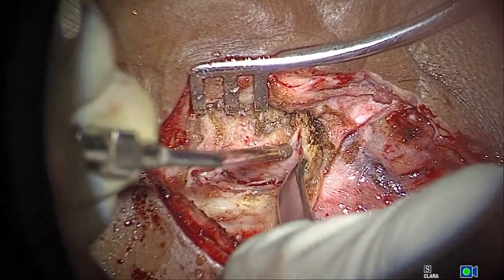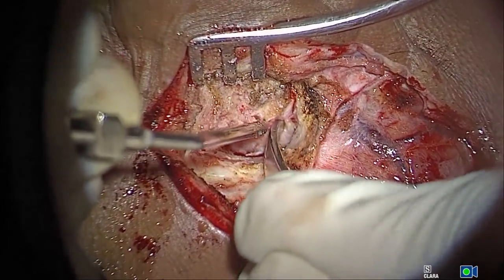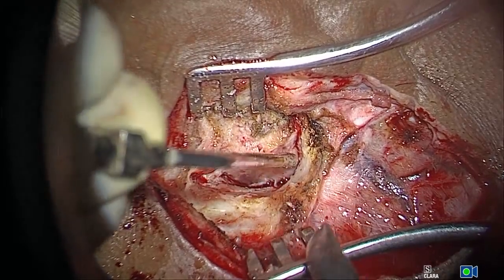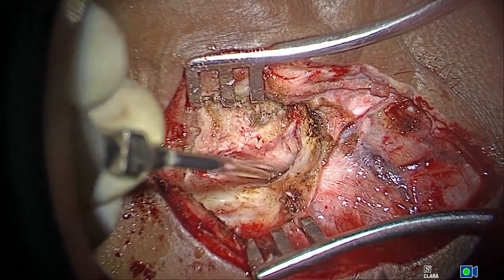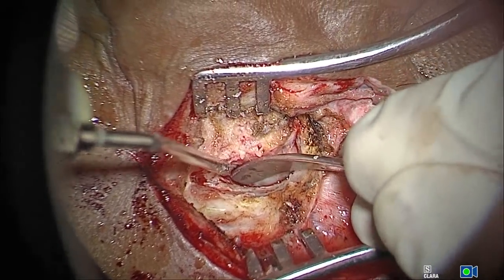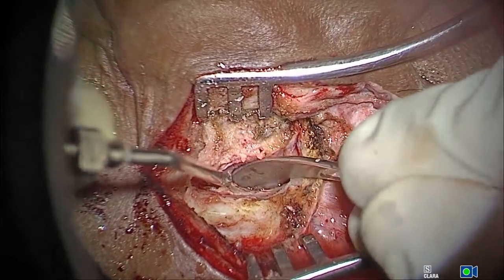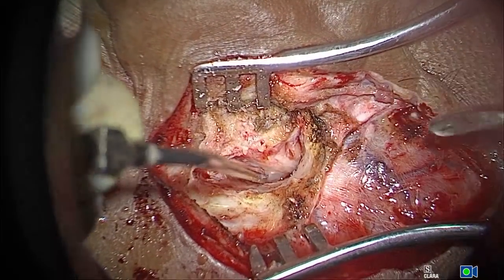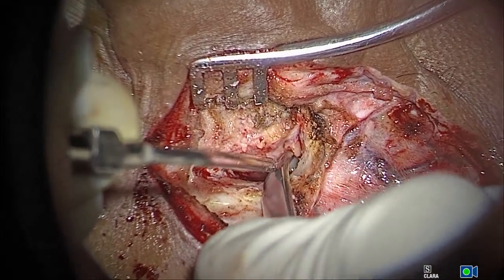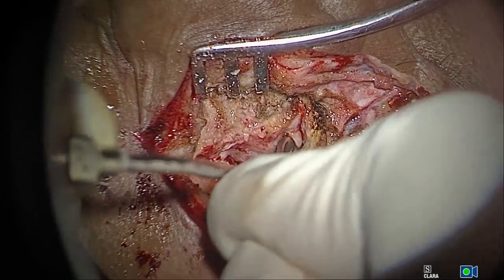So the next case will be a cholesteatoma. You will be seeing a cholesteatoma after this. Of course, this is a central perforation. See here, there's a tympanosquamous suture line. See how prominent this tympanosquamous suture line is. This is a very prominent tympanosquamous suture line, so that also I may require to drill. I don't like to have big suture lines, big Henle spine and things like that.